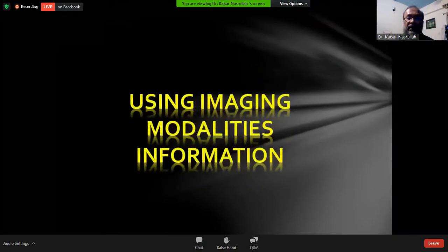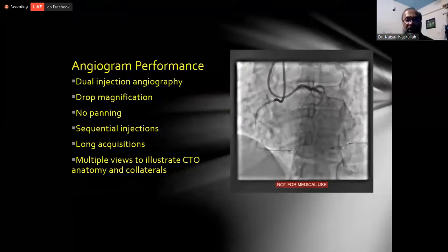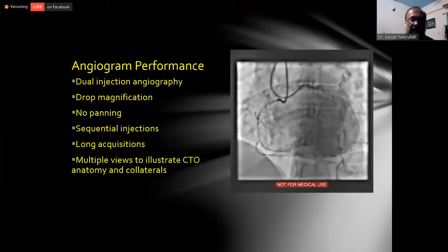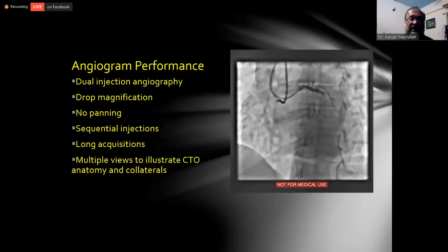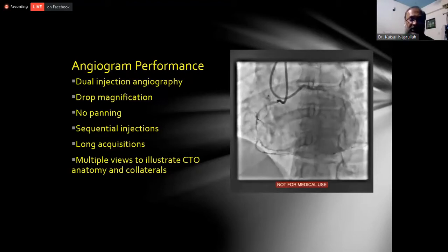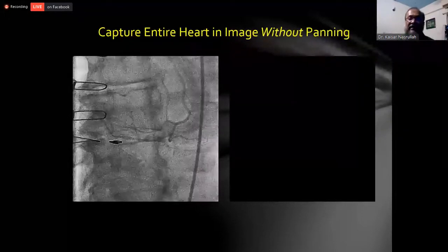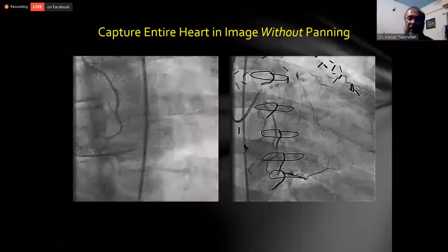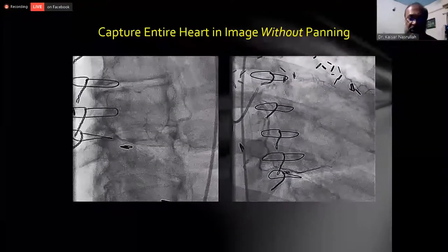First, using imaging modalities information. You have to do the angiogram very carefully: dual injection, no magnification, no panning, sequential injection, long acquisition, and multiple views to illustrate CTO anatomy and collateral. Now, this one is done with panning, which lets you understand the collateral, but you should not do any panning, so you can understand the collateral better for retrograde CTO intervention.